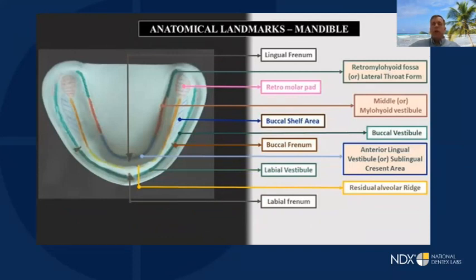So when we're looking at our mandibular impression, one of the things I'll say that you as clinicians can help your laboratories with is that sometimes us laboratories don't realize that dentures are different than crown and bridge. A lot of times if we have a slice margin or something like that with a crown, we're just trying to get all the way down to the depths of the tooth. And we're like, okay, well, I covered everything, so I think I got the margin. As you know, with dentures, because we have two basic types of tissue, tissue that's supported by bone and tissue that's supported by muscles, we want to make sure that we only cover the tissue that's supported by bone that'll be nice and stable. And first, you've got to capture all those things for your laboratory.